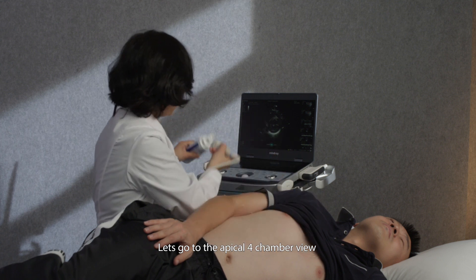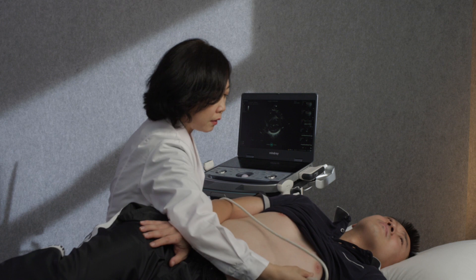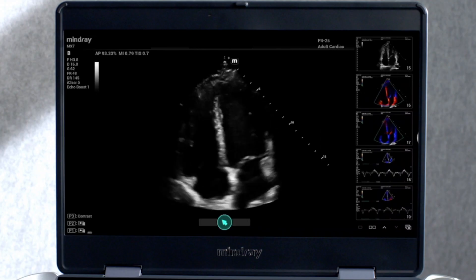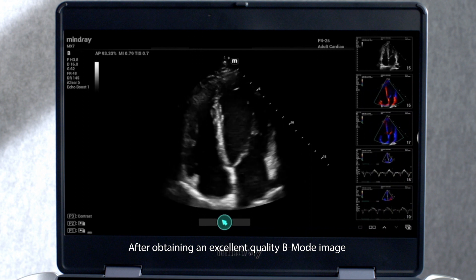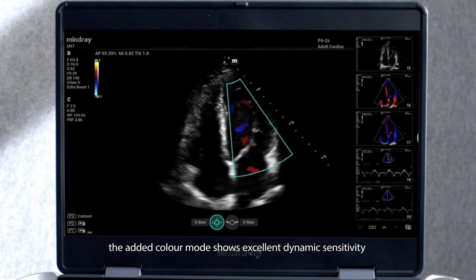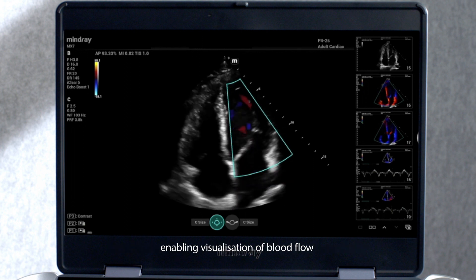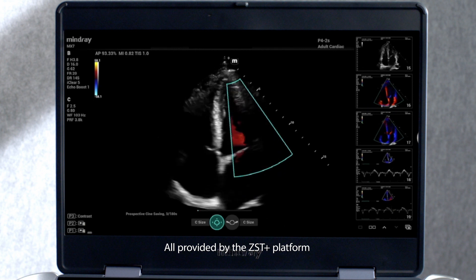Let's go to the apical 4-chamber view. After obtaining an excellent quality B-mode image, the added colour mode shows excellent dynamic sensitivity, enabling visualisation of blood flow — all provided by the ZST Plus platform.